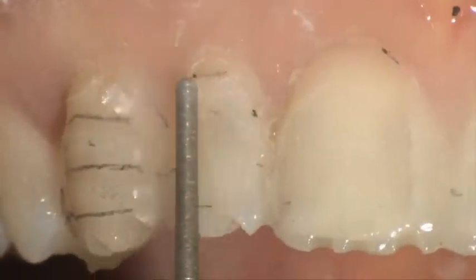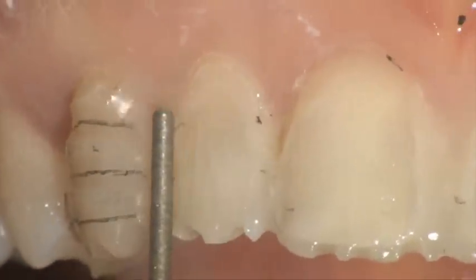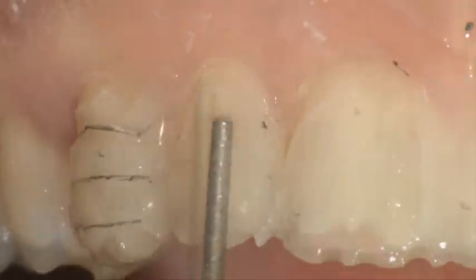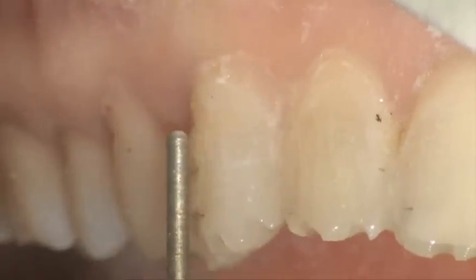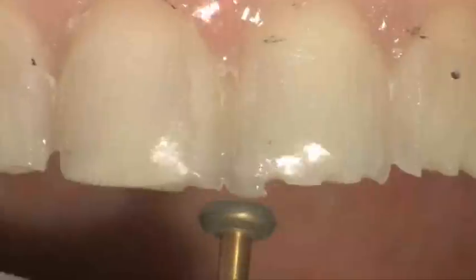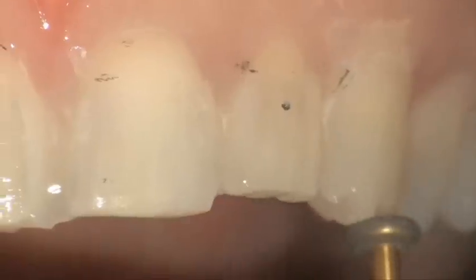As you can see, drawing some lines to the bottom of the deep cut is useful to drive the axial preparation, avoiding grinding away healthy enamel, essential for the adhesion and longevity of the final restoration. Particular attention should be paid to the soft tissue, especially during the finish line preparation.